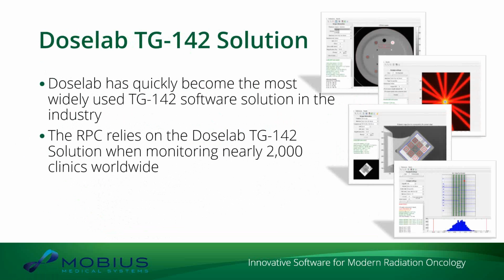I think all of that has really paid off. DoseLab has quickly become the most widely used TG-142 software in the industry. And even the RPC, they actually rely on our system when they go out and monitor the nearly 2,000 clinics that they monitor worldwide. So I think that's a really great endorsement to have the RPC trust our software for doing that.